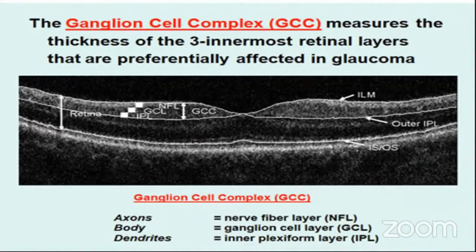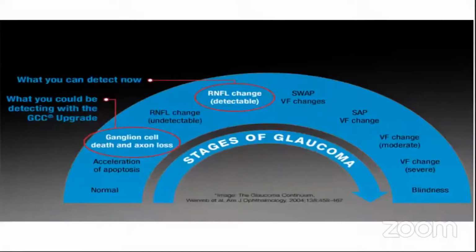So this is the brief introduction to the ganglion cell complex. Then why should we study it, or how is it indicated in glaucoma? In the different stages of glaucoma, in the first case, if there is no suspicion of glaucoma, there is normal thickness in both the retinal nerve fiber layer and the macular ganglion cells. After the patient becomes a glaucoma suspect, in the first stages there is change in the ganglion cells.